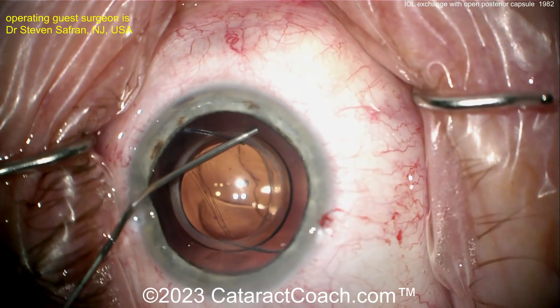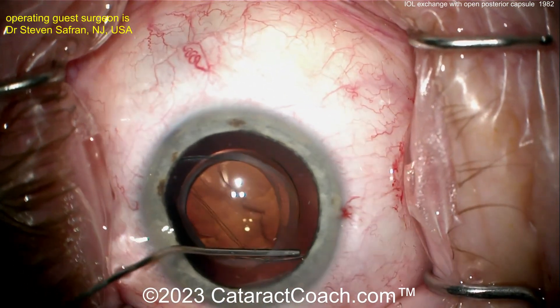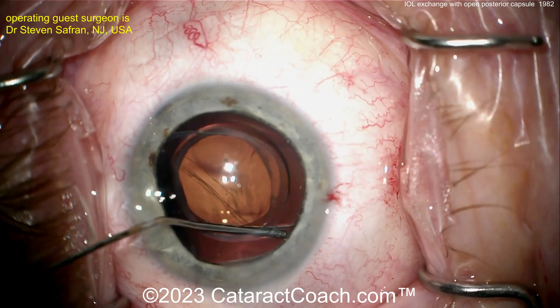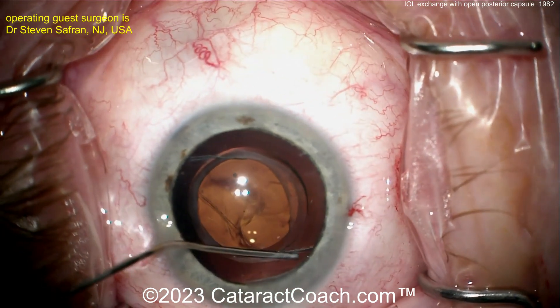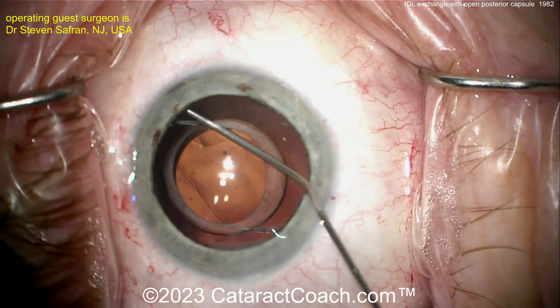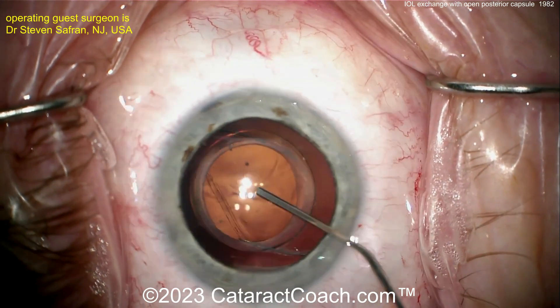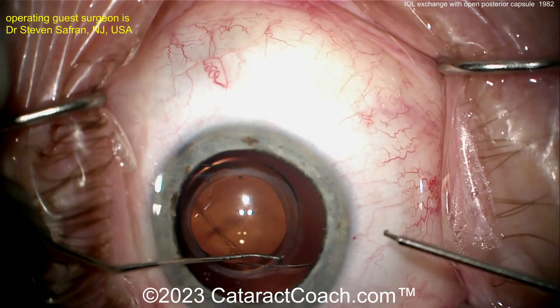Going back to the dispersive viscoelastic — slowly, slowly injecting it to get this lens free. The haptics look like they're glued in place; it's very difficult. The surgeon is trying to inject viscoelastic down the fibrotic tunnel around each haptic. The same approach is used on the other haptic — working viscoelastic down that fibrotic tunnel to help release each haptic from its position in the bag.